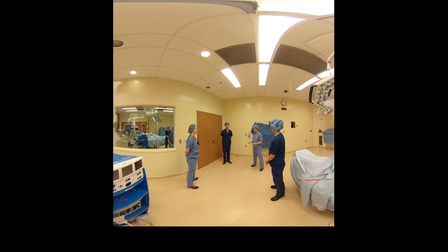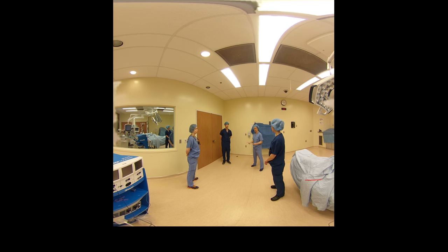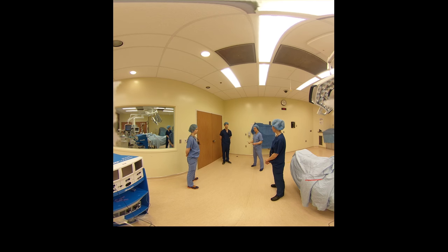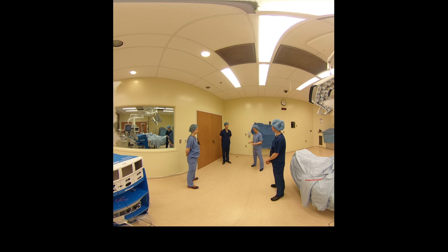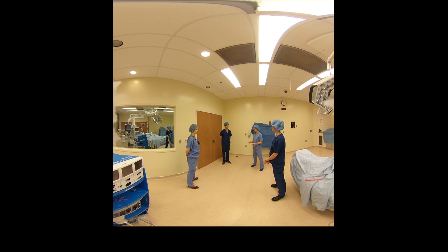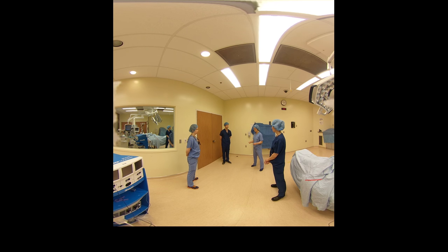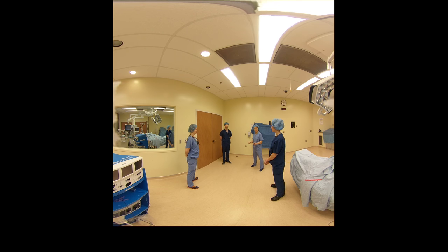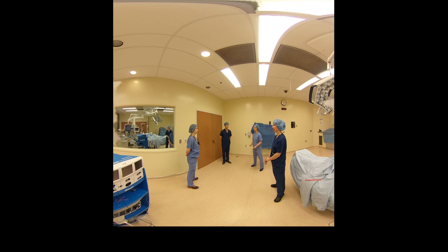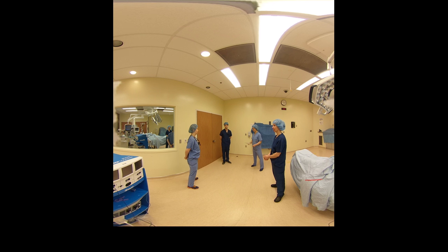Inside the room will be the four of us. I have an anesthesia assistant who will remain clean to be my clean assistant. We have another scrub nurse who's going to remain clean and an attendant as runner. We've clarified our dirty areas are going to be around the patient and the equipment used there. I have a drop bucket for all contaminated equipment. Anesthesia equipment has been checked. I have my induction agents, vasopressors, and we have three airway trays and HEPA equipment outside the room.